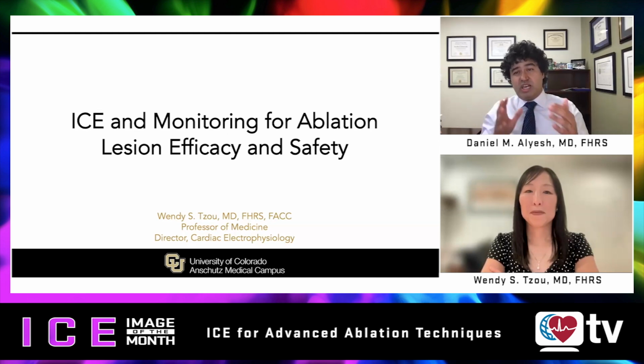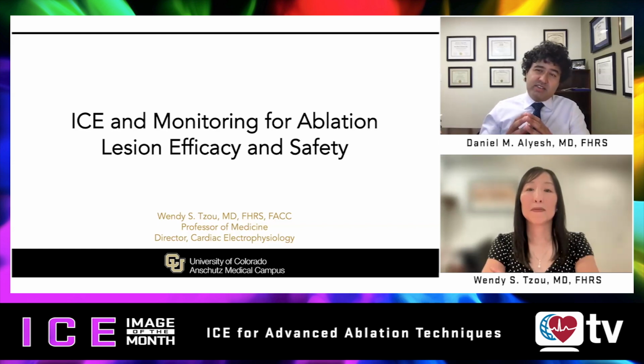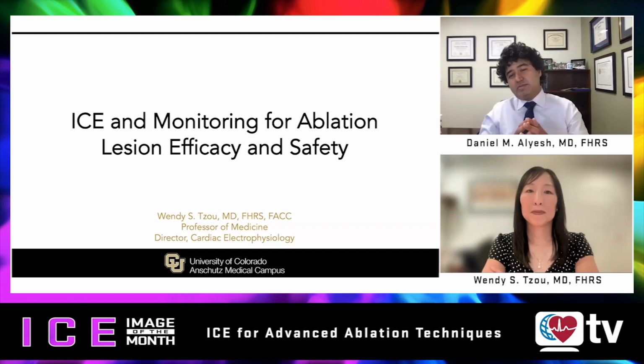base for monitoring lesions with ICE and how it correlates to lesion size. Then we'll progress to some advanced ablation topics using hypotonic irrigant or half normal saline and using ICE to monitor lesions. We'll then proceed to bipolar ablation and using ICE to monitor lesions in that circumstance. Then ethanol ablation, really gaining popularity in the atrium and the ventricle. We'll see how ICE can be used to monitor the lesion efficacy in that circumstance, and then conclude with some of the data that Dr. Tzou and colleagues have also done for understanding the risk of steam pop using ICE.